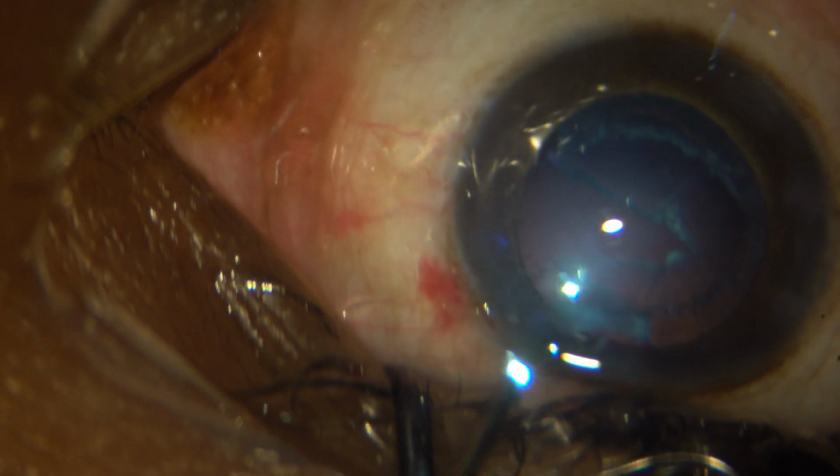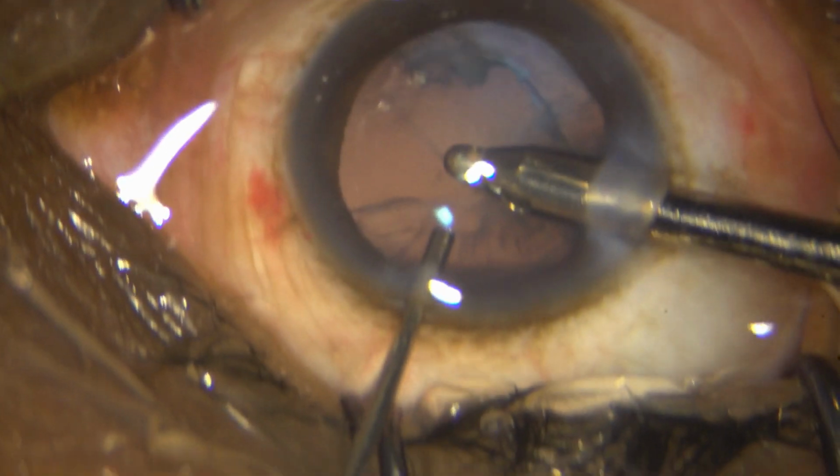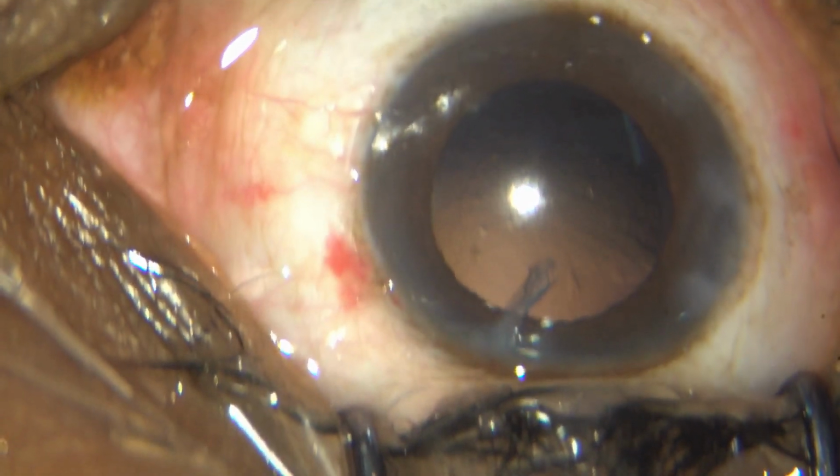So again, I come out. This time I go in with my coaxial. And again, I put in the endo illuminator and put off the lights. This is not a good idea, to crush with the endo illuminator, but I have no choice. And there you can see, I know there are two large cortical bits. That's one done. And you have to be a little patient about it, because those fibers that you can see are actually the vitreous highlighting, and the cortex is done.